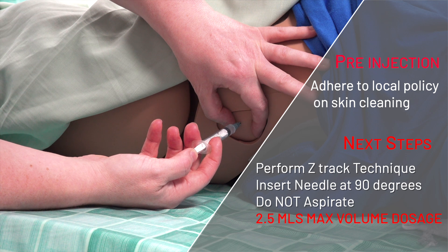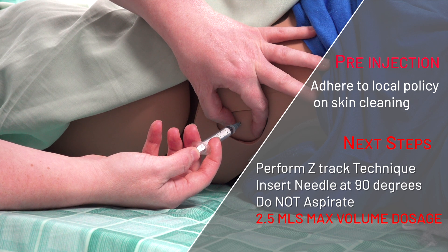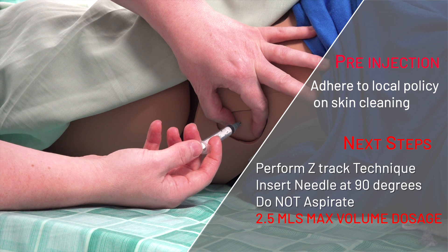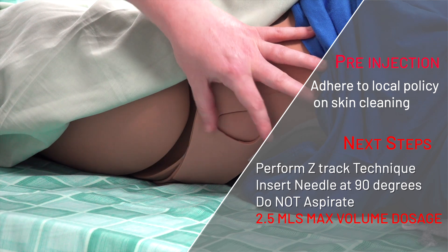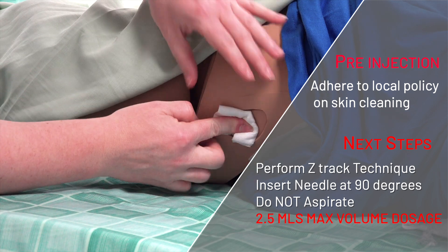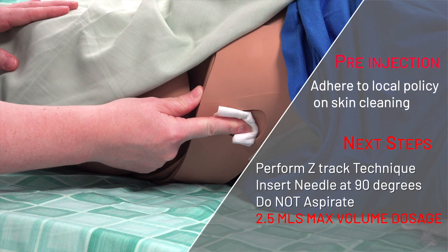Wait 10 seconds before withdrawing the needle to allow drug dispersion. Let the skin return to normal to seal the drug in the muscle. Apply pressure to the site with dry gauze as needed.